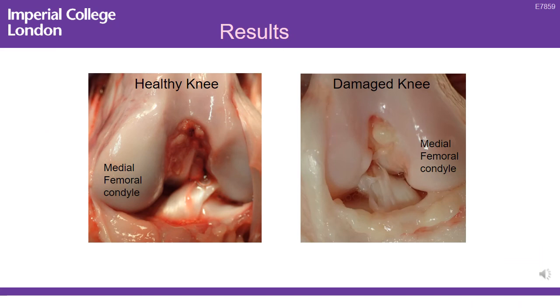During a 6-month data collection period, 10 knees were included in the study. 2 were found to have ligament pathology, which was identified by the vet during the joint dissection. Here are some post-mortem images which show the shiny, healthy ligaments on the left and the partial rupture of the anterior medial band on the right.